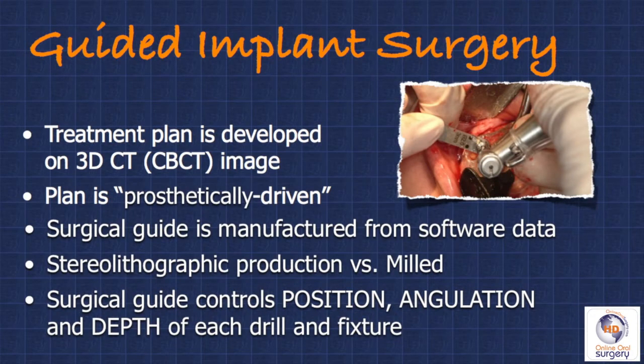Now that the tooth is out and the socket is clean, we're going to be placing our implant using guided implant surgery. This means that we did all of our treatment planning on a 3D CT image in our Galileo software. The benefit of doing guided surgery is that we can do this case completely prosthetically driven — we start with our final prosthetic result and work backwards from there to determine where the implant needs to be. We send this data off to Germany, and a surgical guide is returned to us made from this data with a sleeve in it. Surgical guides are produced by either a stereolithographic technique or, as with the Galileo surgical guide, they're milled from a solid piece of material, which I find to be much more stable and to have a more accurate fit.